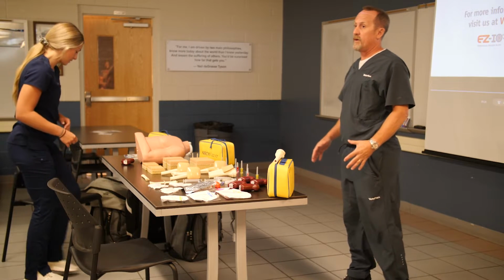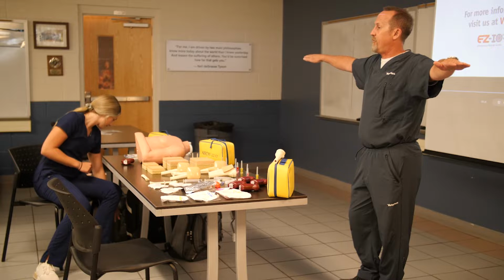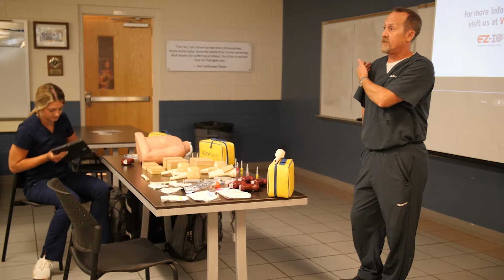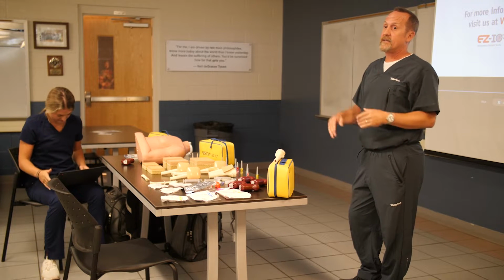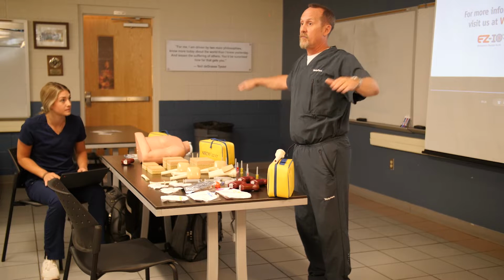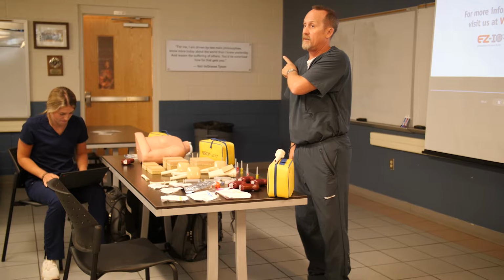The thing that we want to keep from happening is for their arms going any higher than this. Okay? If we get their arms, so we're going to strap them to the Lucas. After we've positioned the arm and put the needle in, we've had that axilla, we've got that tendon out of the way. If we put their arms up like this, it's not going to be detrimental to that IO. But if the arms get above their head and start moving, these muscles bunch up and that tendon starts floating back and forth. It's going to try to eject the needle or bend it.